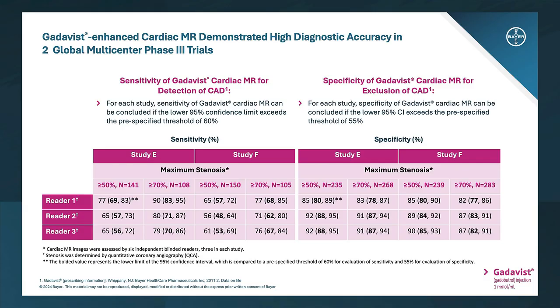The left ventricular myocardium was divided into 6 regions. Interpretations were provided per region for cardiac MRI, reporting presence or absence of perfusion defect and or LGE, while QCA results showing presence or absence of stenosis of greater than or equal to 50% or greater than or equal to 70% were provided per artery.